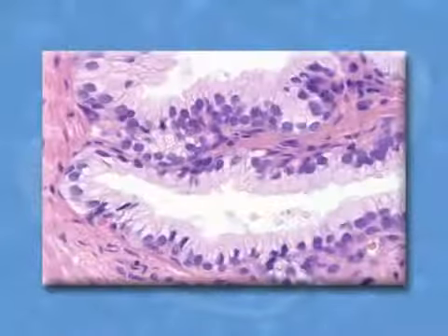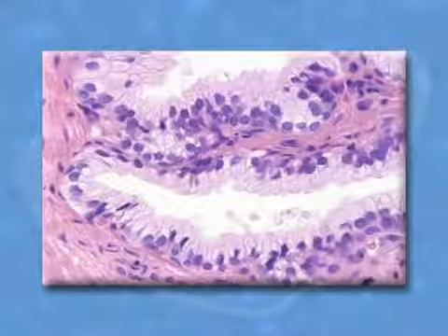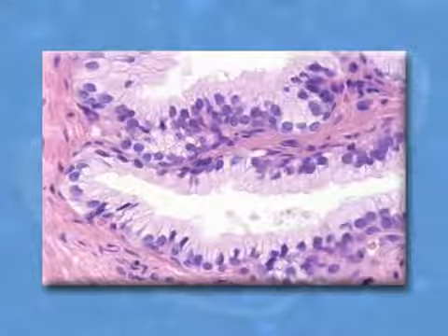After your biopsies, the specimens were sent to the pathologist, who looked at the tissue under the microscope to determine whether or not cancer was present. As you can see in this illustration, this is the appearance of normal prostate tissue under the microscope.